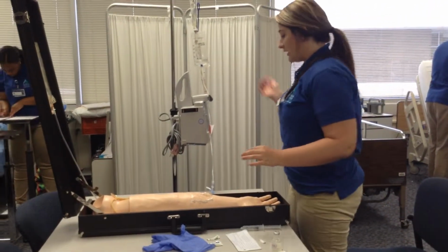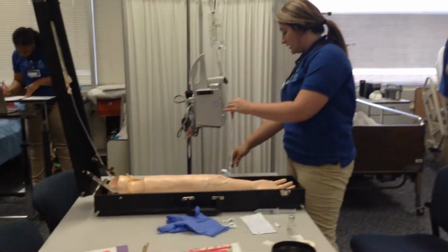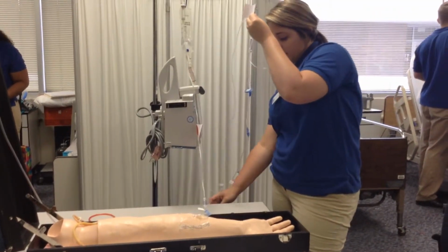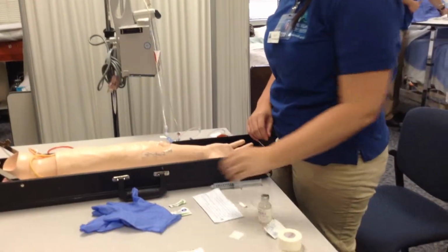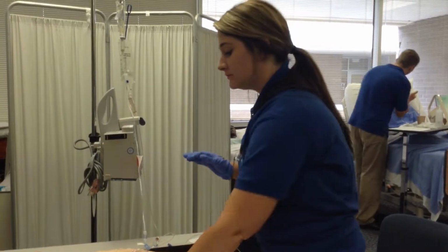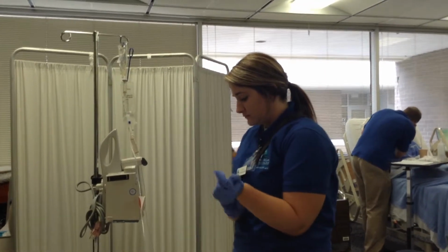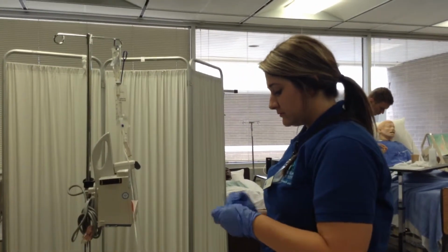Then when it's complete, I would clamp my mini bag and unclamp my primary tubing, which is also labeled. With another alcohol pad, after I have washed and regloved my hands, another alcohol pad.